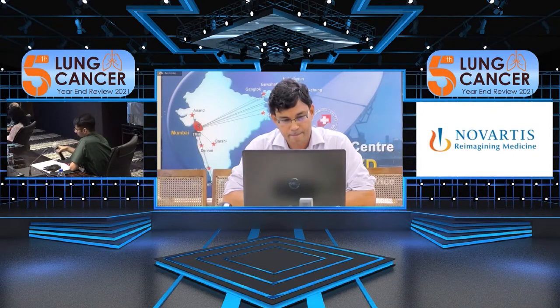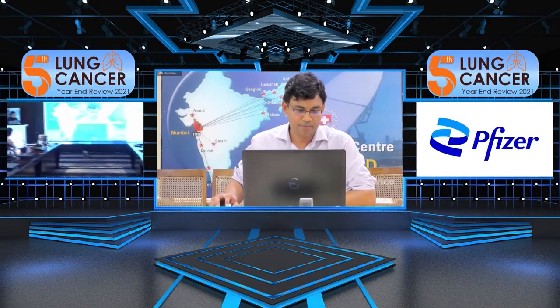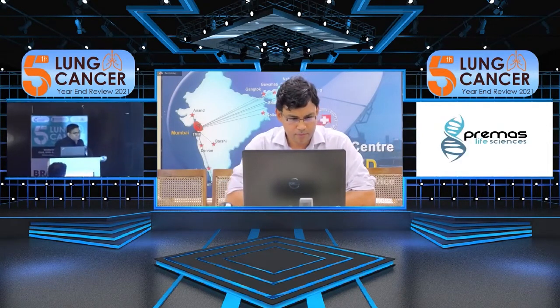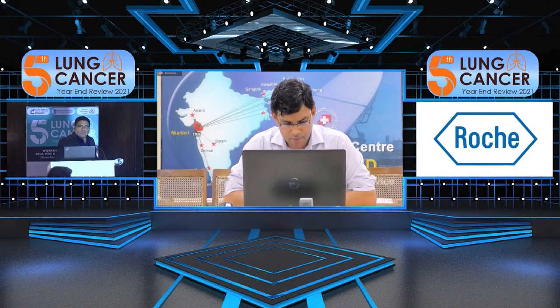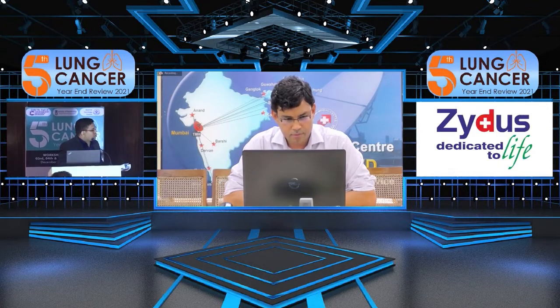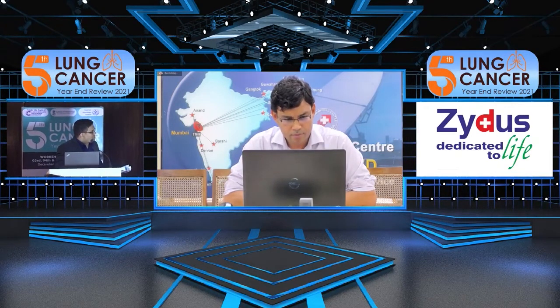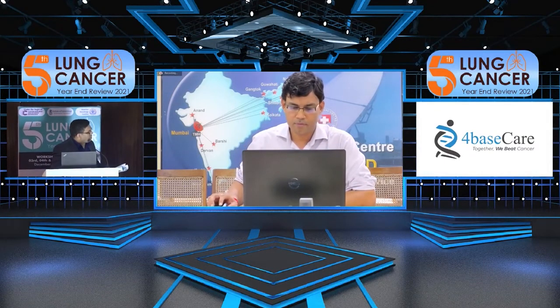Thank you. Amit, I have a few questions for you. Vijay here. At Tata, it's easy for us: we ask for an MRI brain for brain mets and you do the brain mets protocol. Can you specify, because when our residents go out, sometimes they need to specify what thickness should be there and with what Tesla MRI.